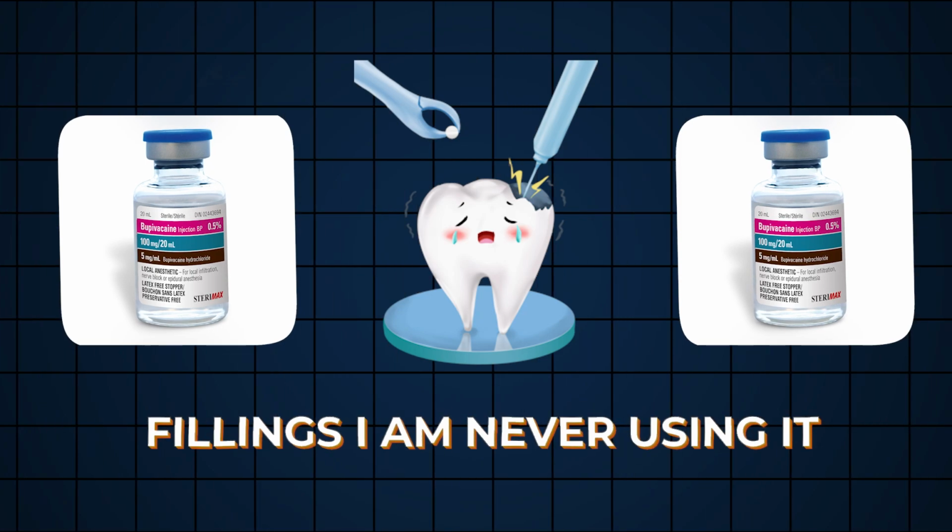For extremely rare cases outside of that, I will do an intraosseous injection. The only other variation is that when we are doing surgery, I will use more bupivacaine for the longer duration just to help keep them comfortable for as long as possible. For fillings, I am never using it. There are lots of variations to try, but this is tried and true and will give you consistency. Feel free to adjust and experiment, but this will start you in a good place.